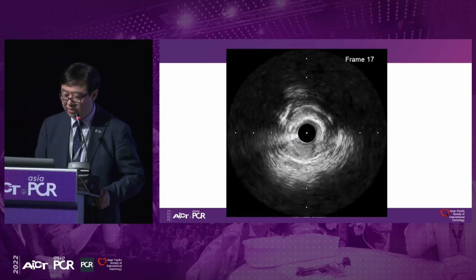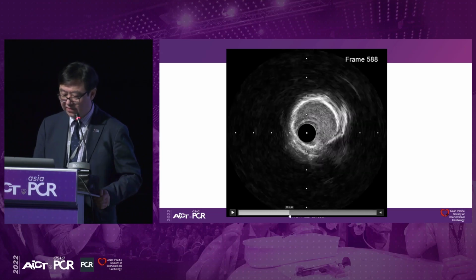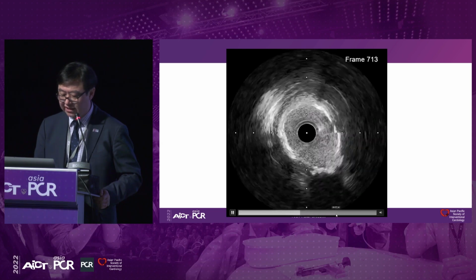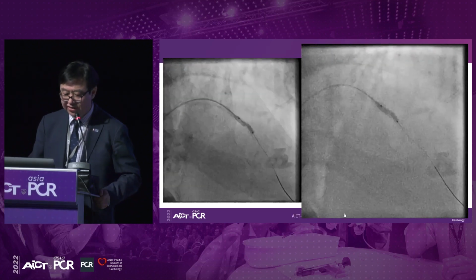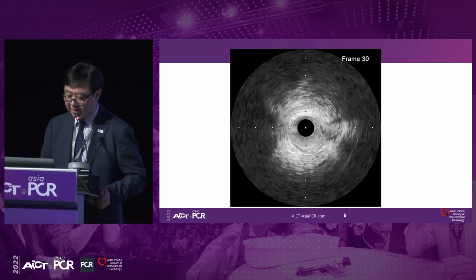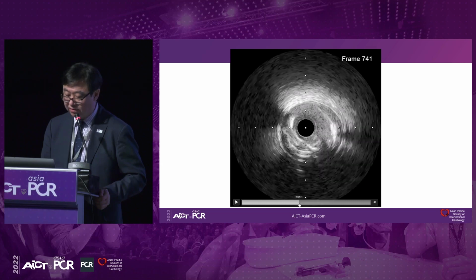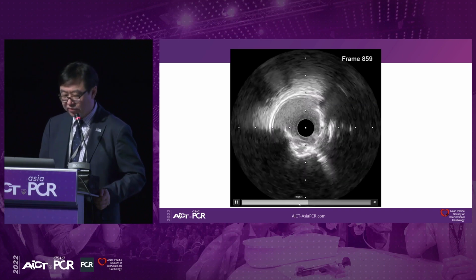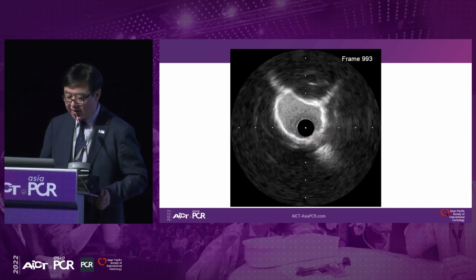And after this, we were able to do intravascular ultrasound and check this, which is an extremely calcified lesion. I'll just go a bit quicker with this. You can see a little signature on the lower left-hand corner. It allows passage. This is a lithotripsy balloon, and the waist is just a little bit better on the right-hand side, so it's modified. And we checked it again using this, and we'll see some cracks occurring in a minute here. The rotor signature, reverberation, and cracks over all the lesion. We thought this is well modified.